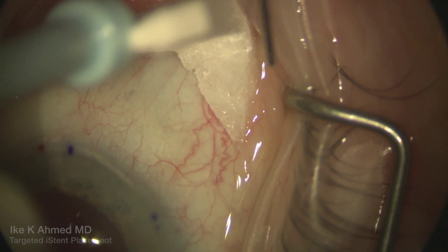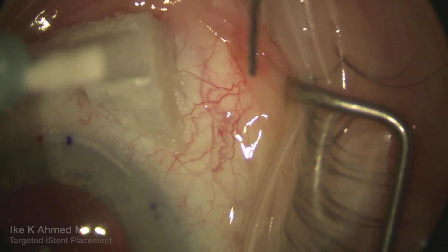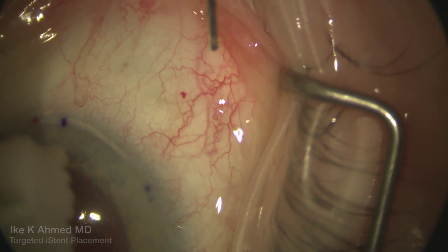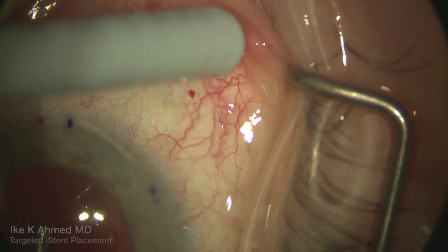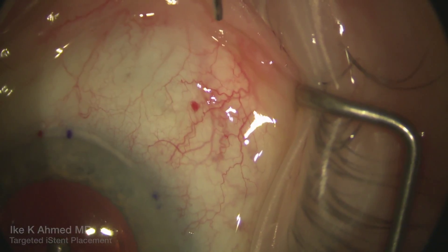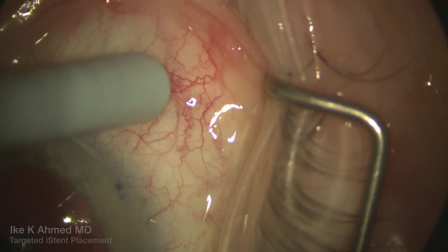The supranasal vein, despite the irrigation into the anterior chamber and the placement of a device in the vicinity where we thought the vein would be emerging from the canal, shows very little blanching — certainly not that major aqueous vein. There is some blanching superiorly, but the aqueous vein itself does not appear to be much affected by the placement of the device.